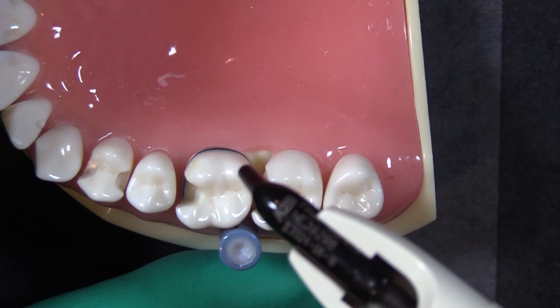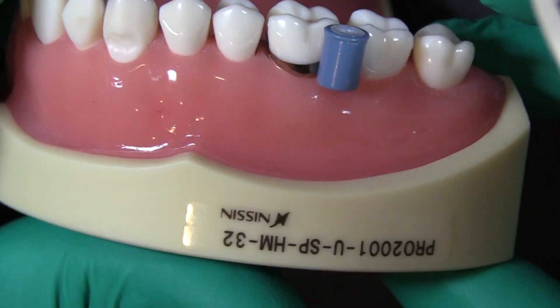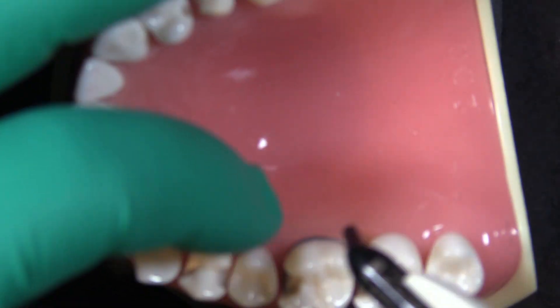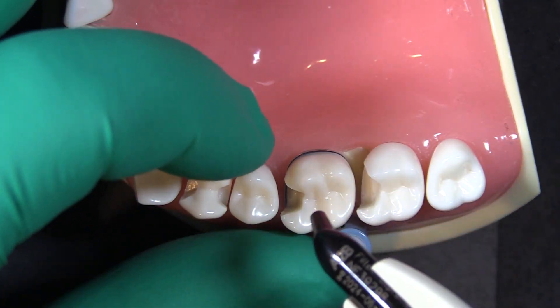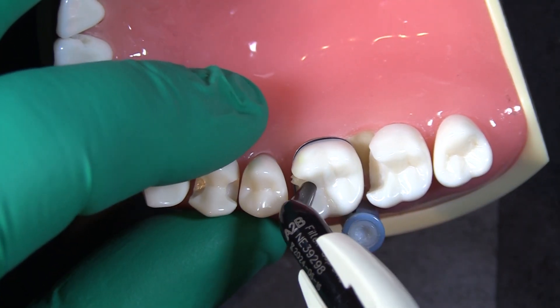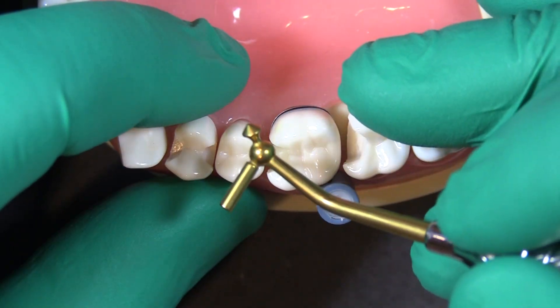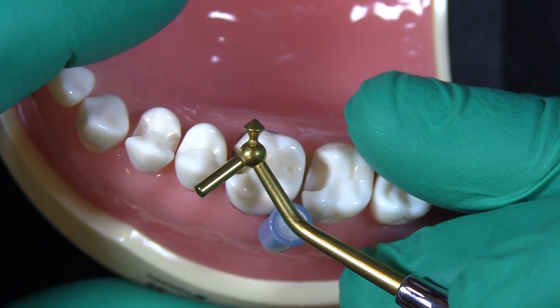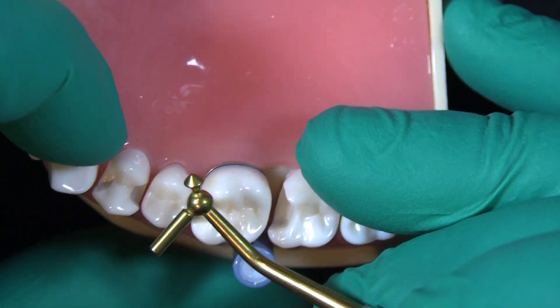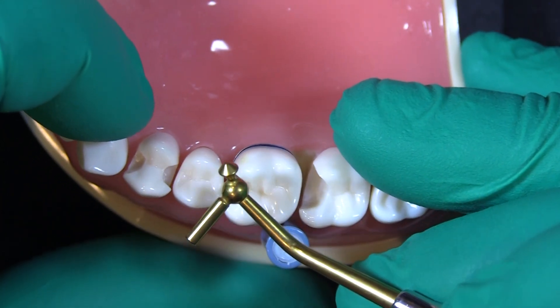When placing our composite, we're not trying to do this all in one fill. In these deep margin elevation situations, we're definitely trying to stay below our contact point, so not a lot of material has to go in. We'll extrude just a little bit of material at a time and use the smallest plugger, pushing the composite towards the sides of the preparation to make sure we're sealing all of those cavo-surface margins.